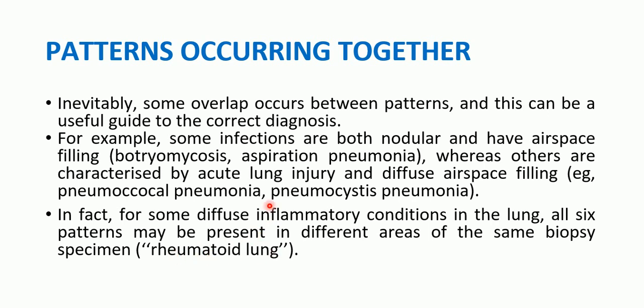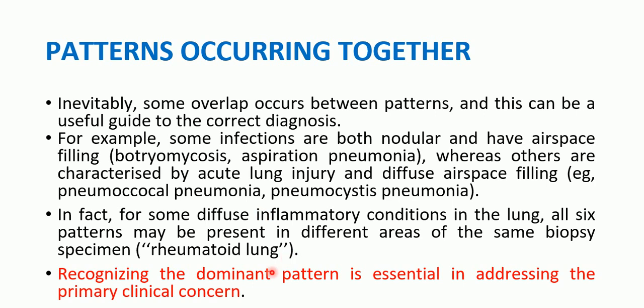So what do we do in these cases? Recognizing the dominant pattern is essential in addressing the primary clinical concern. So the patterns are going to overlap. You have to recognize the dominant pattern to come to a conclusive diagnosis and help the clinician.